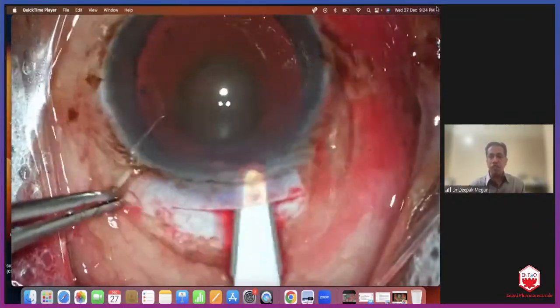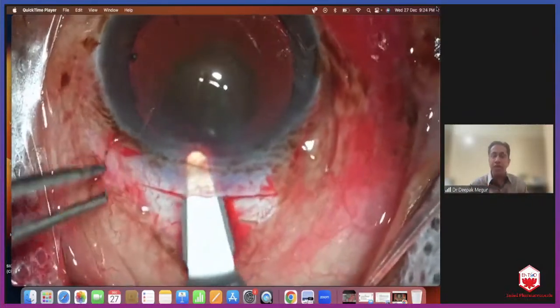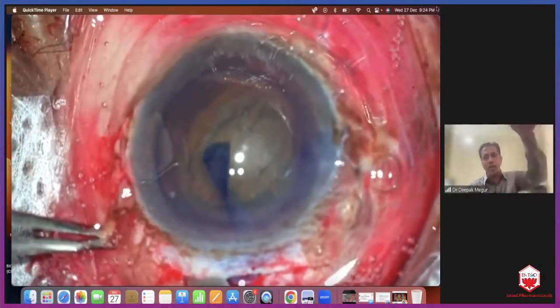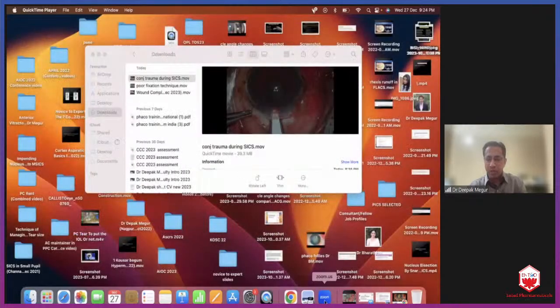Many times, if you see junior surgeons doing this, we end up having a 180 degree peritomy or even sometimes 360 degrees, if they hold in the inferior part, it will ultimately join. So I think these are some of the basic concepts which I'd like to highlight. And with that, I'm going to conclude my presentation.